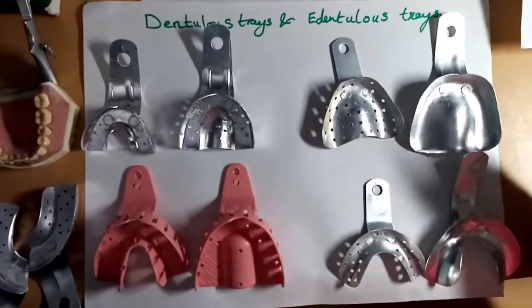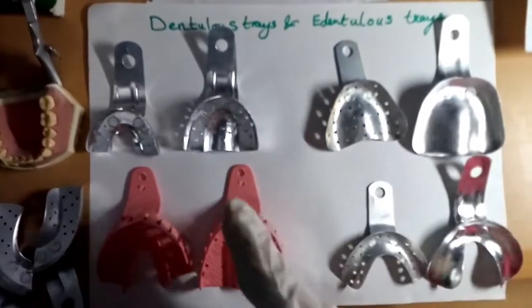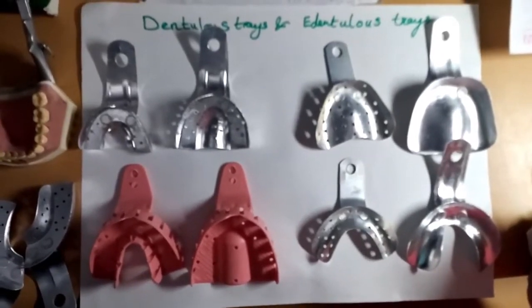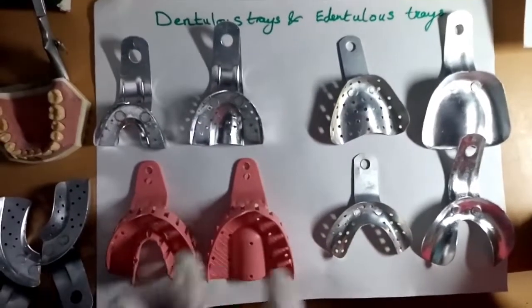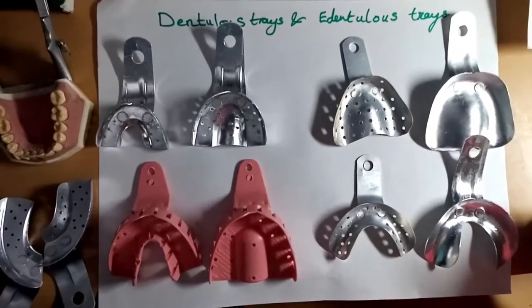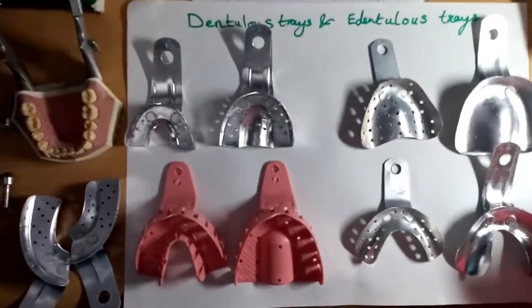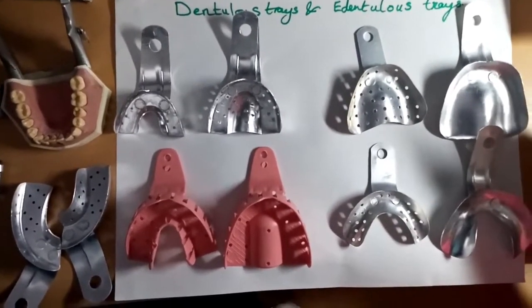Then we have another classification: perforated and non-perforated. Can you see? This depends on the type of impression material I'm going to use. In case of alginate, we use the perforated impression trays. In case of impression compound, we use the non-perforated impression trays.